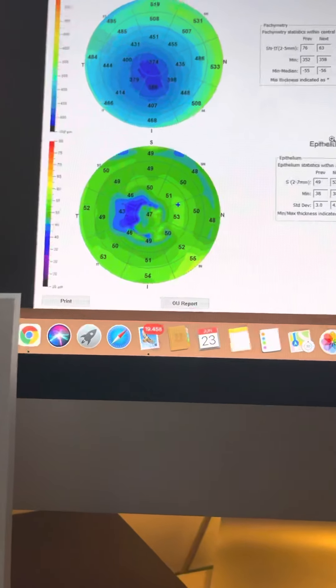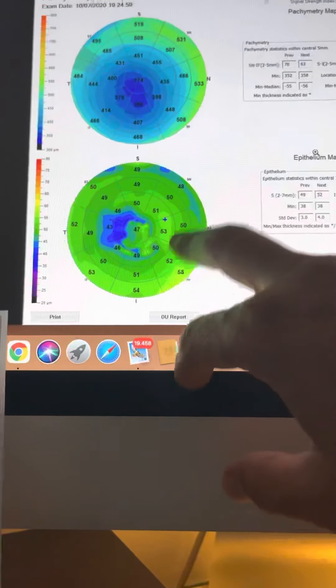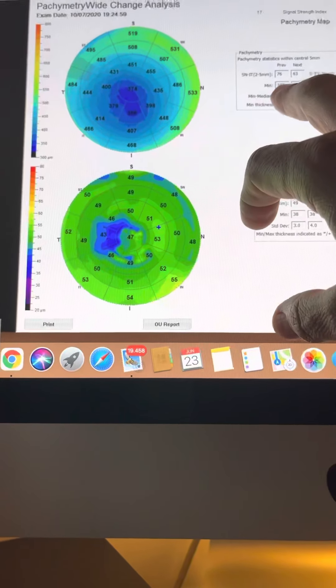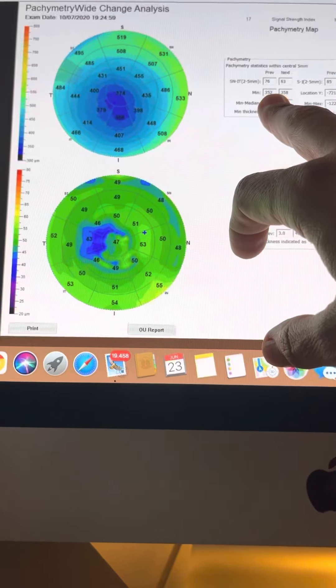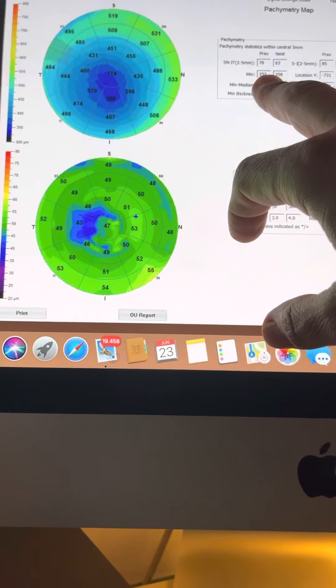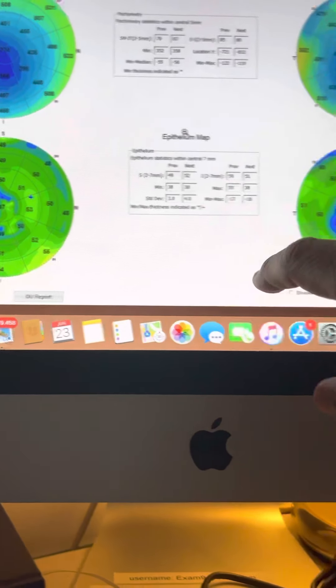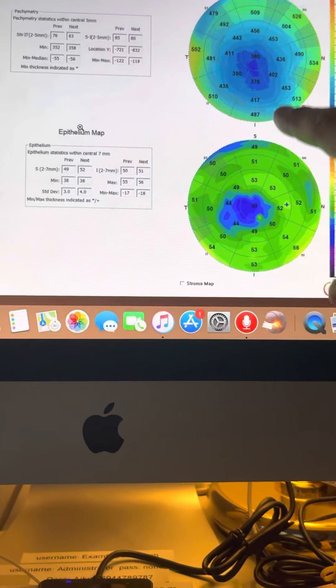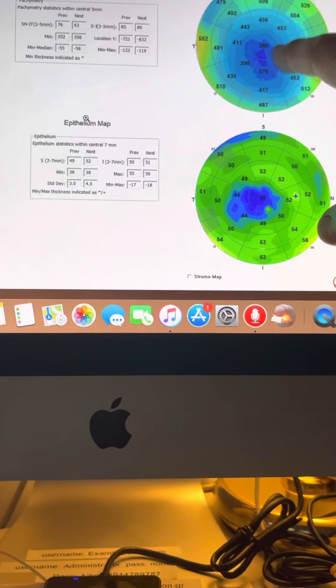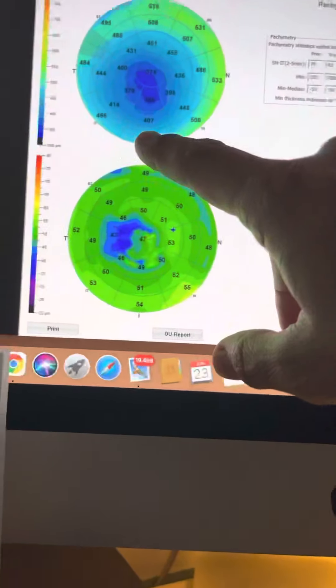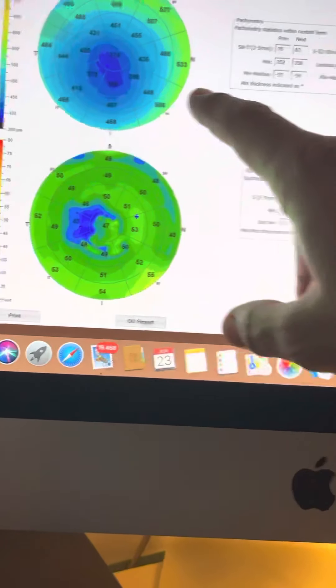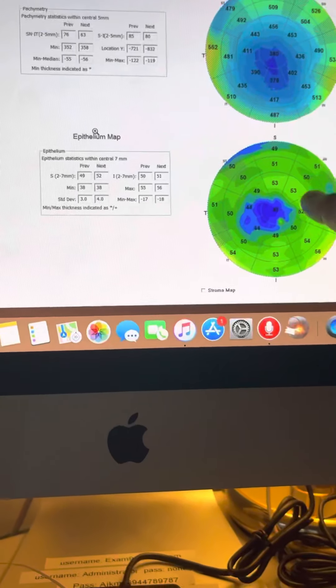We do have comparisons from last year for this right eye. Last year minimum thickness was 352, this year is 358. We can see there's no significant change in the overall cornea thickness.